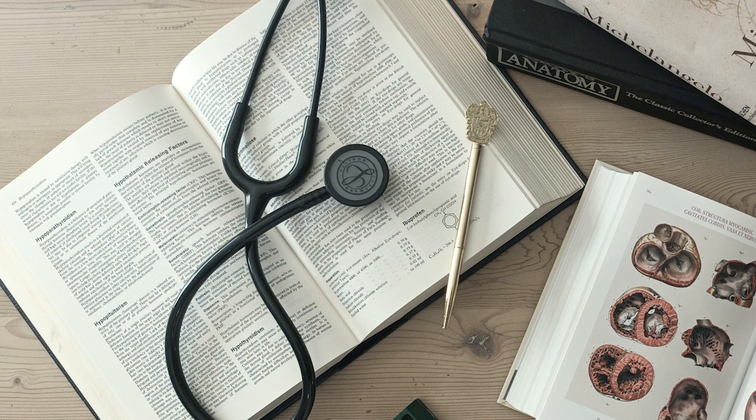Where do these ones come from? This type of VPC originates from non-conducting myocardial tissue within the ventricles, not from the bundle branches or Purkinje fibers directly. The abnormality in appearance, the wide, complex, and abnormal axis, is due to this slow cell-to-cell conduction, as it's not following the normal, rapid Purkinje highway, and the abnormal direction of depolarization due to its ectopic origin far from the normal pathways.